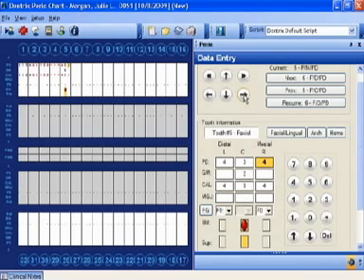But as you use it, and especially with the audio feedback where it's repeating the numbers for you, you won't find that you're making many mistakes.